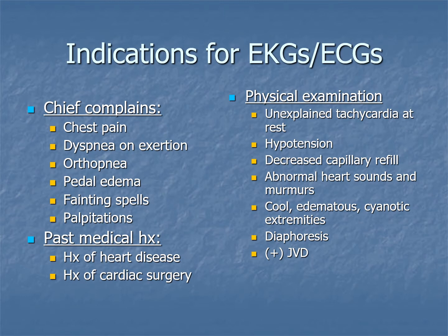Okay, but chest pain that's not due to orthopedic issues, things along those lines, is a potential indication for an EKG. Dyspnea on exertion. Now, if you exert yourself enough, you're going to get dyspneic. But we're really talking about somebody who has had progressive dyspnea on exertion, so that now even their activities of daily living are becoming an issue. They probably should have an ECG. Orthopnea, which is the difficulty breathing in a lying down position. So you may have somebody who needs 3 pillows in order to sleep, or sleeps in a recliner. And they may have a cardiac history. It may be an indicator that they have or are developing congestive heart failure.